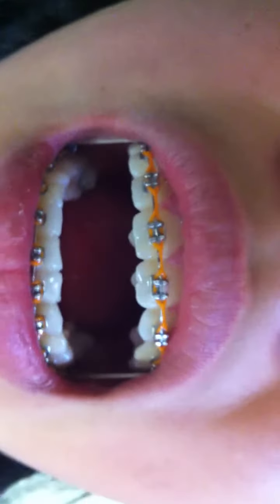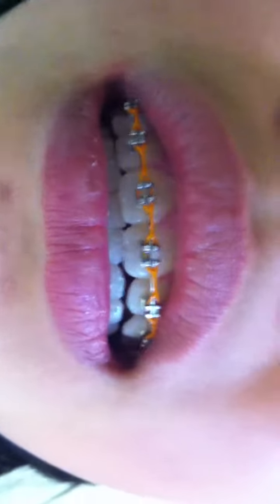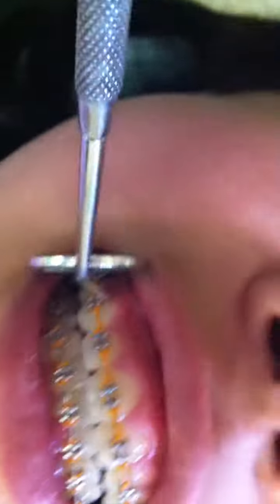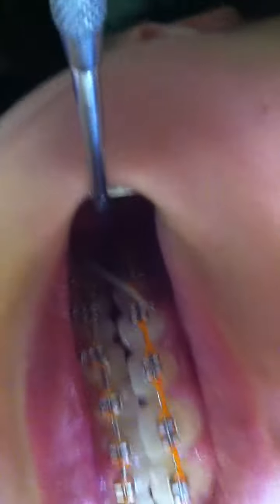From the front you can just barely see it — bite down again. So now every time she bites down she has to bite in this position. Eventually her mouth would be trained to be in this position all the time.